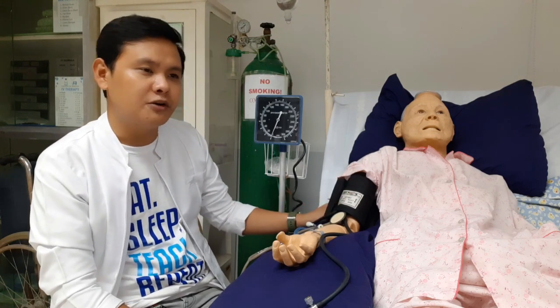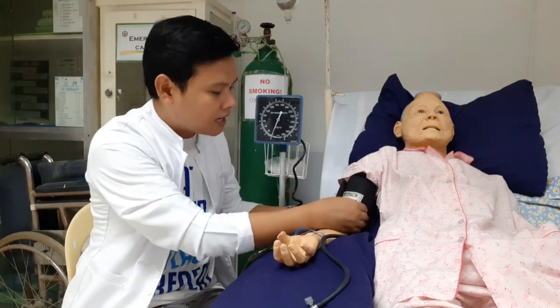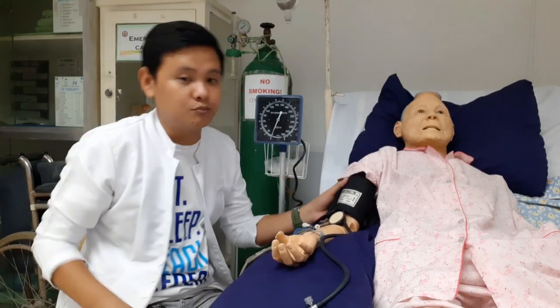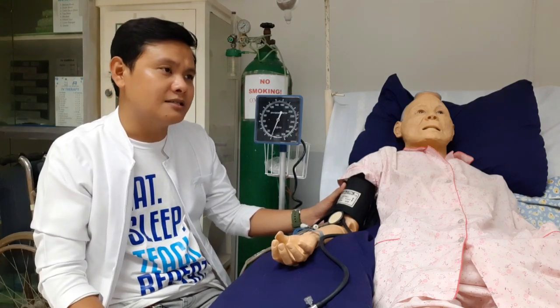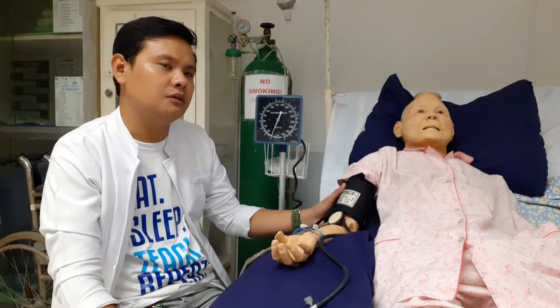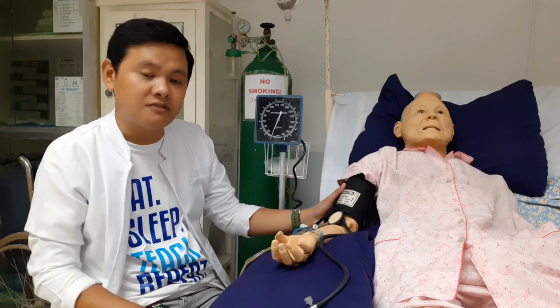So, if you are using your personal BP cuff, better na nilalabhan or nililinis yung BP cuff. Natatanggal naman to okay? Yung rubber, yung pinaka-cuff natin, andun po sa may loob, rubber po yun. Pwede yung tanggalin and then lalabhan mo itong tela na nakabalot. You can do that. Okay? So you have to wipe the cuff with an approved disinfectant as much as possible. Okay? Kung personal naman yan, tsaka ginagamit mo lang naman yan for the client, well, it's up to you. Pero para sa akin kasi, yung mga personal ko na gamit, I make sure na dinidisinfect ko yun.